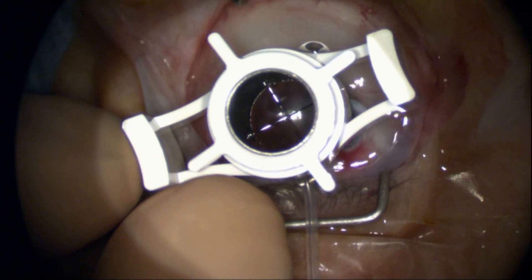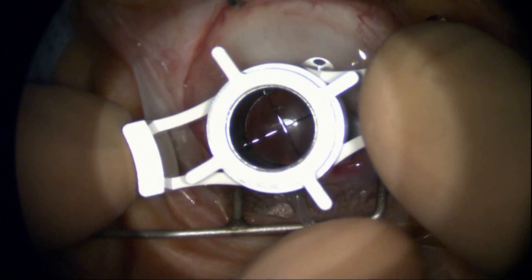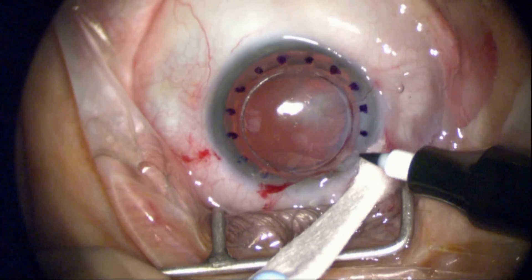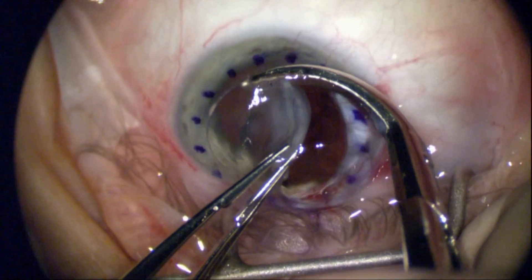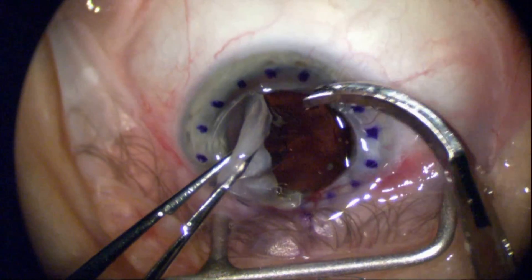I'm going to just barely get through Descemet's membrane and then release suction. I'm going to mark the suture placement marks here, and I'm just going to remove part of the cornea.